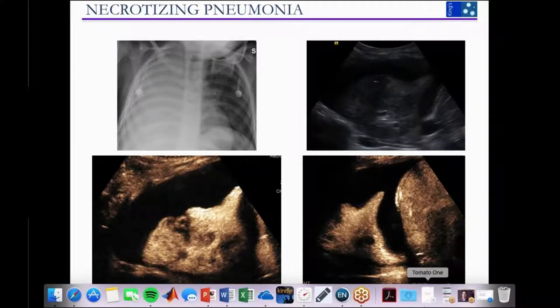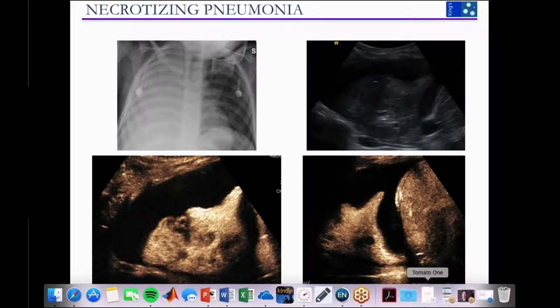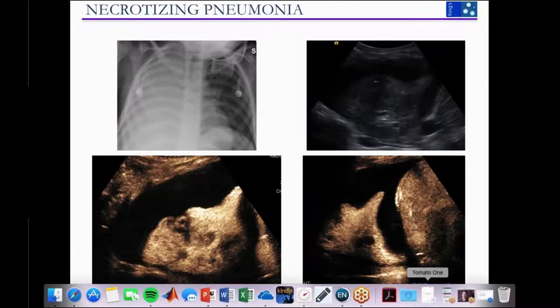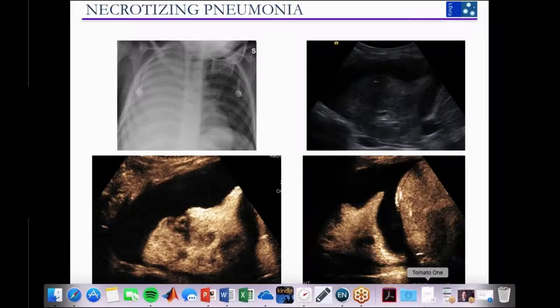Another necrotizing pneumonia on the opposite side — the mediastinum is shifted toward the right. Is this all necrotic collapsed atelectatic lung, and how much surrounding fluid is there? IV contrast shows collapsed lung with surrounding empyema and substantial fluid. Even though there was significant empyema on the X-ray, the mediastinum wasn't shifted because of the underlying atelectasis and necrotic lung. The bottom left picture shows an area of breakdown of the visceral pleura — this child developed a bronchopleural fistula — demonstrating that CEUS can preempt possible complications.